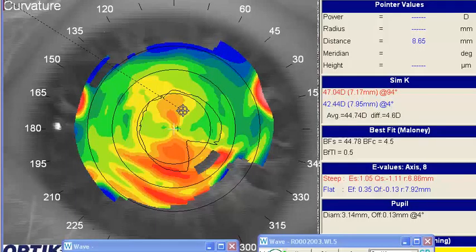I see from your clinical request you have a challenging patient with tight eyelids and small eyes, and you've achieved success, from my understanding, in the left eye with a semi-scleral design, and the right lens you're quite close. However, the lens is popping off the eye on right gaze, from my understanding. When I looked at your designs, the designs actually look very good, and it sounds like you're very close to being successful. But a couple thoughts.